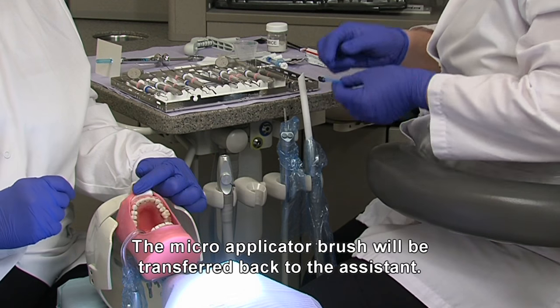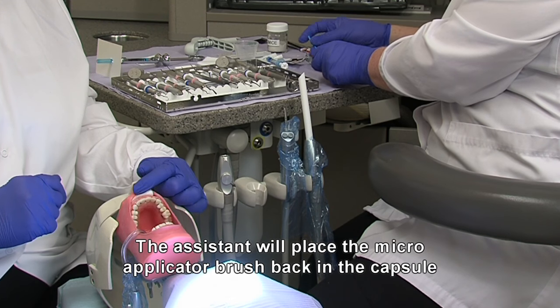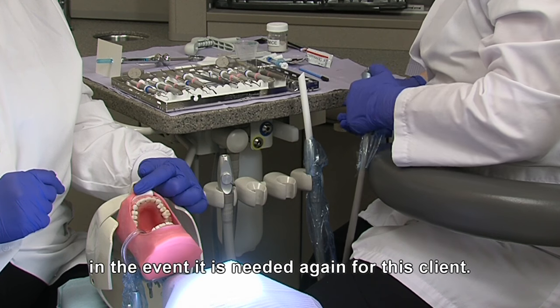The microapplicator brush will be transferred back to the assistant. The assistant will place the microapplicator brush back into the capsule in the event that it is needed again for this client.